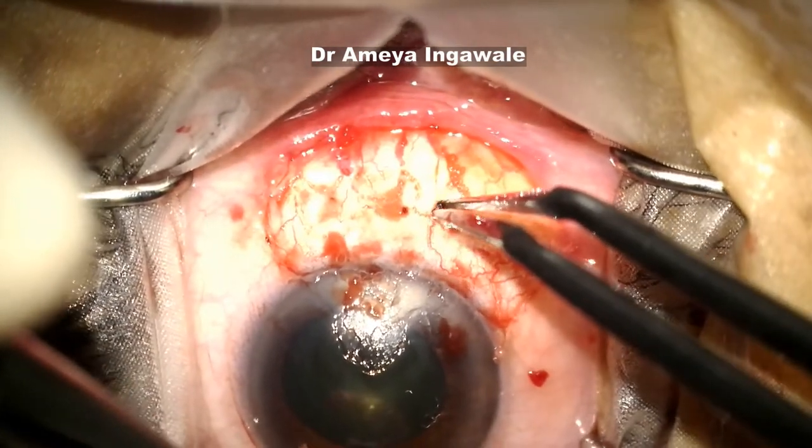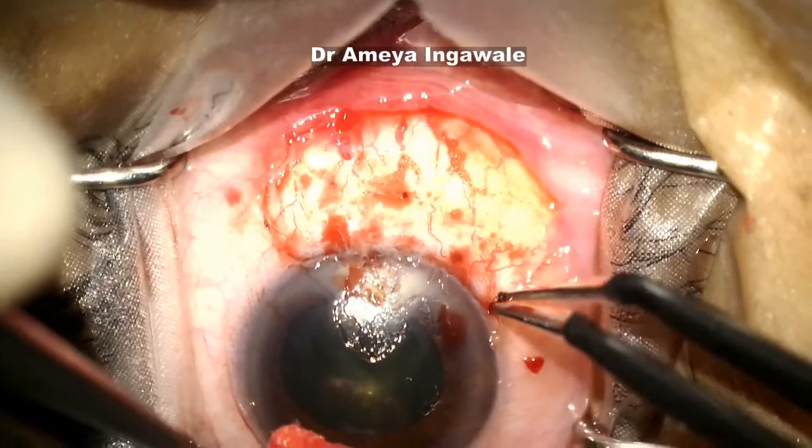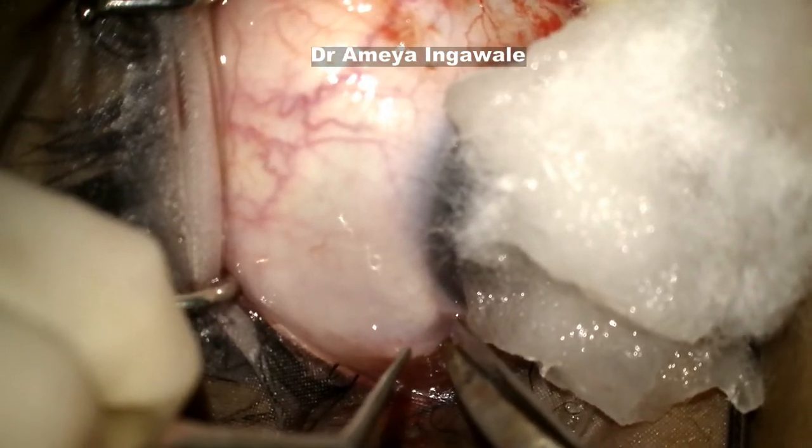You can apply some cautery. There is no need to heavily cauterize that area — just a bit of cautery to prevent a large hematoma forming under your graft later on. That's about enough.